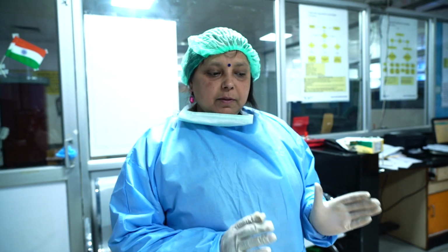So we have to continue this chest compression, ventilation and use of the AED till the pulse appears in the victim. Meanwhile, if the patient is in the ICU or in the SDU, we will prepare for an immediate hysterotomy as soon as possible while trying to resuscitate the victim, because delivery of the fetus is equally important. As soon as the hysterotomy incision is made and the baby comes out, the resuscitation of the pregnant woman will become much easier.